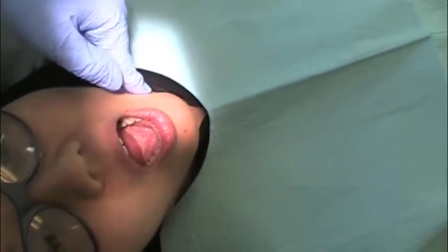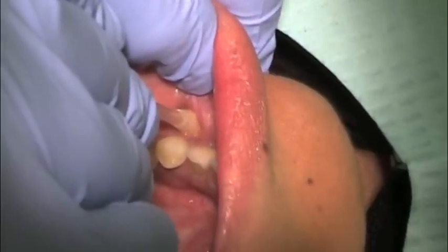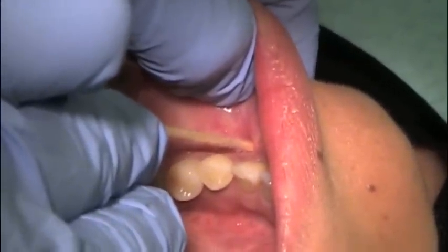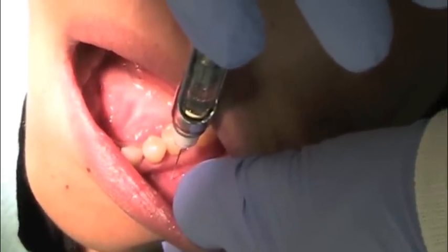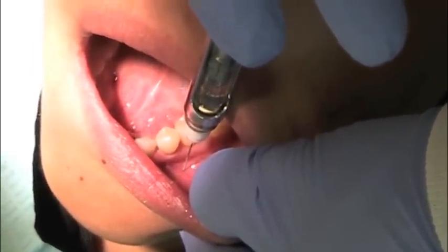First, identify the mental foramen. Then apply topical at the mucobuccal fold above the target site. Position yourself at 12 o'clock. Insert the needle parallel to the long axis of the tooth. Insertion is until osseous contact.